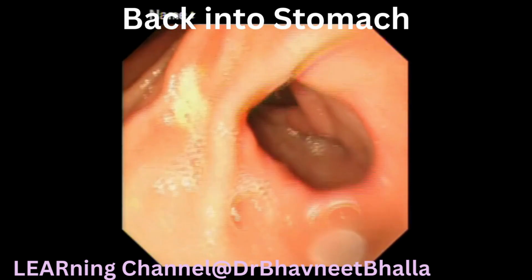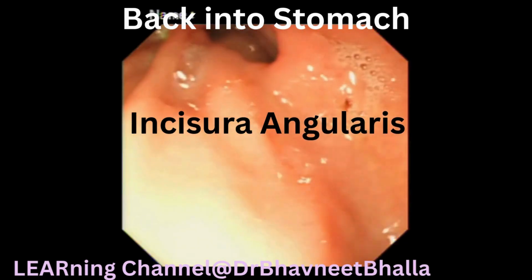Now, insufflate the stomach, then start doing upangulation of scope to see the incisura angularis.